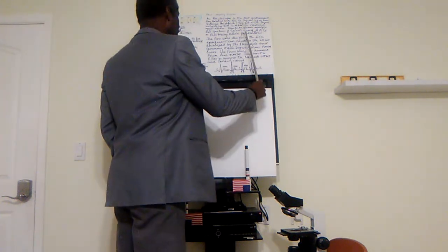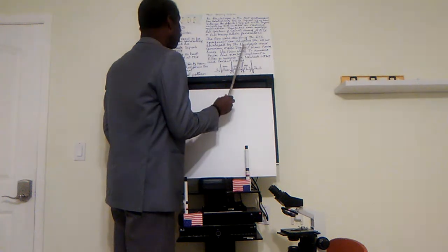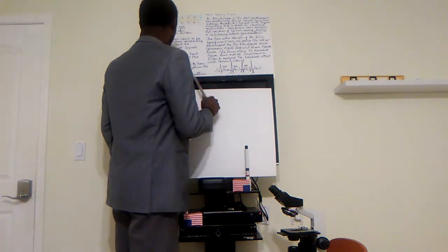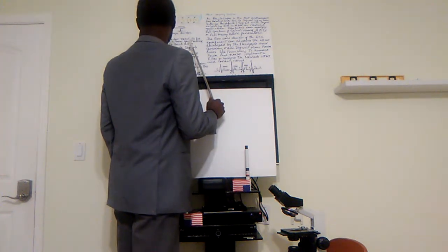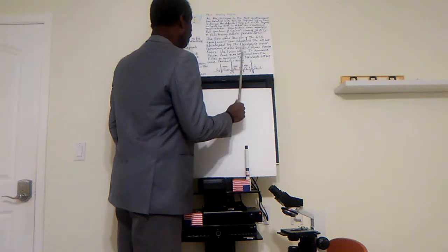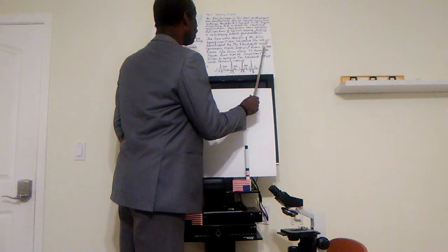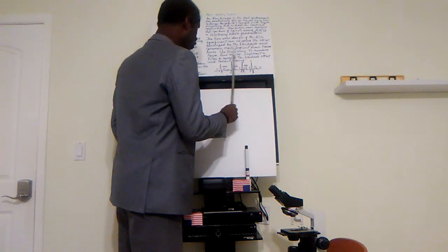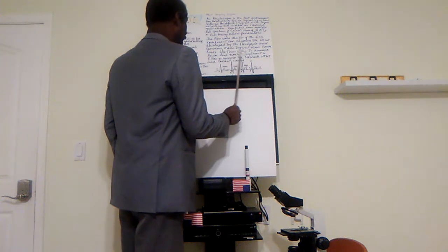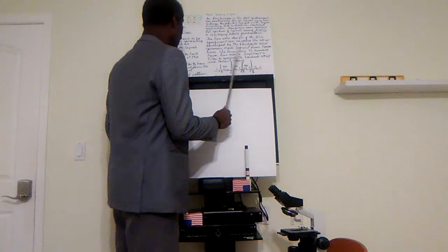Now the firmware design of the ECG equipment can resolve the offset developed by the electrode and the common mode signal from the power lines, which were factors 2 and 3. They can use notch firmware to remove the power line noise and implement a filter to remove the electrode offset and correct noise.